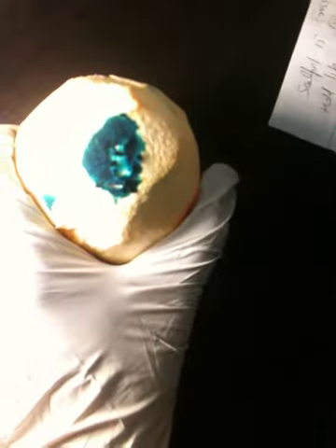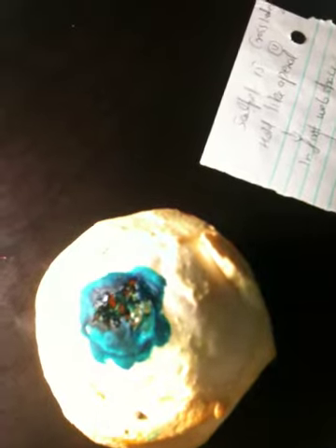So we're going to start with the third part of the experiment, which is a little different, where we're trying to debride necrotic tissue from the muscle. Going on the back side of the wound, you can see it's a big wound in the muscle, and what we're going to do is use the scalpel and the scissors.